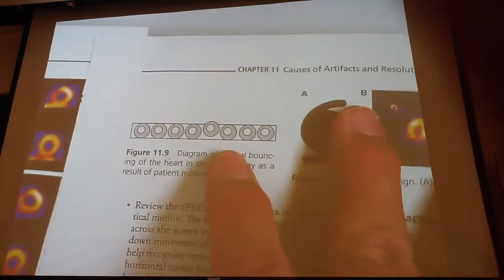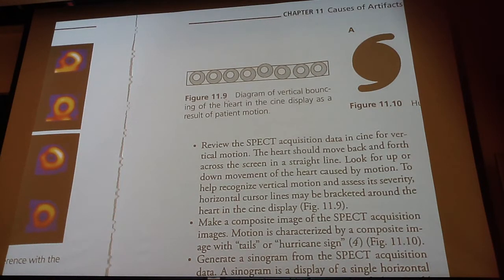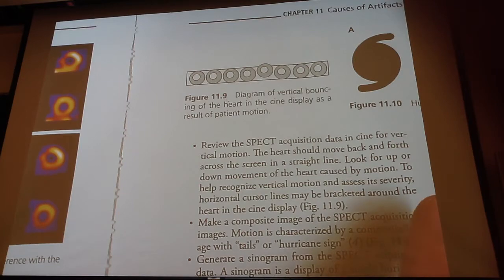The other thing is this: you guys are supposed to look at the image reconstruction, the dynamic mode on the cine display. How many of you guys do that? You know what you're looking for. Looking for jumping on the Y-axis. Yeah.